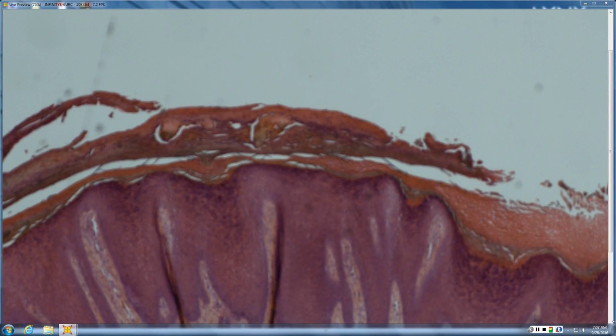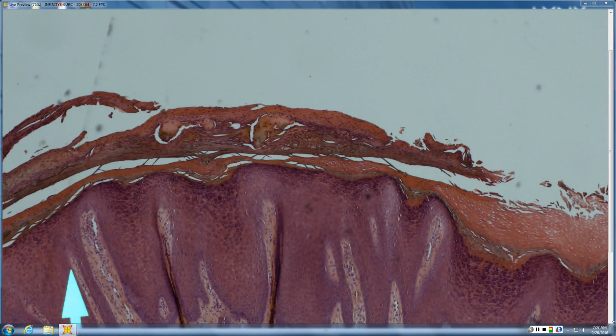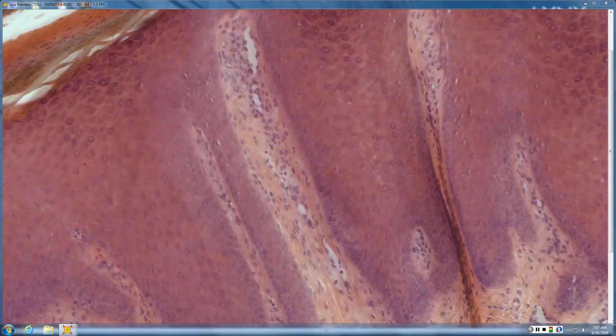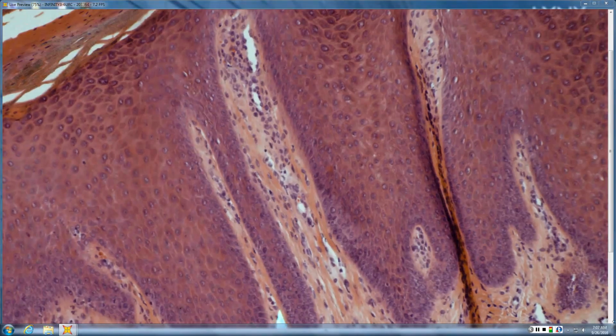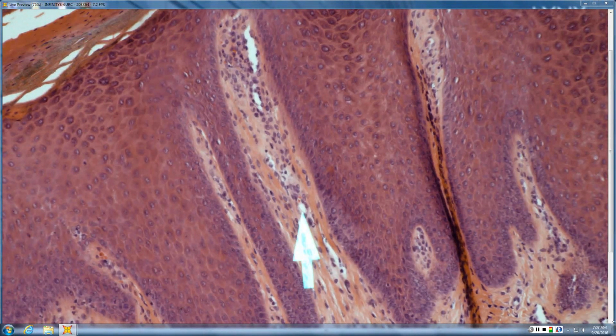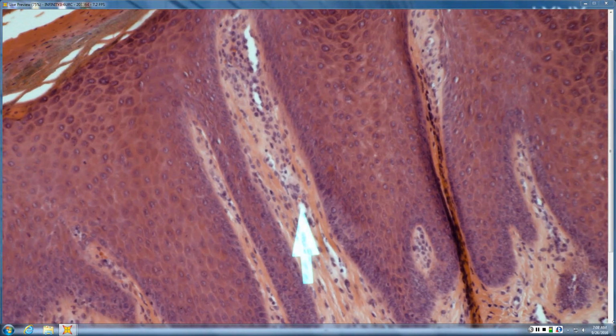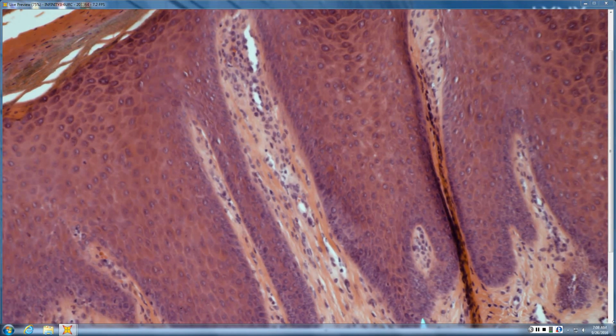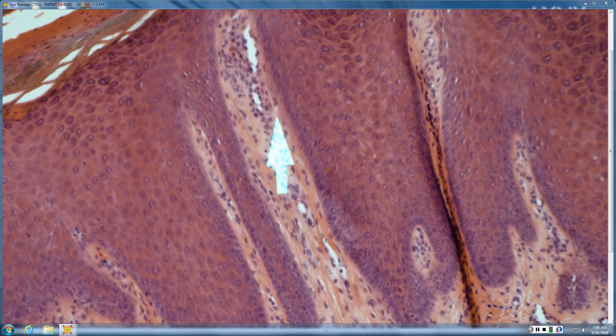But another thing to distinguish the two is this papillary dermal fibrosis that's particularly with vertical streaks of collagen. So that is different from psoriasis and something that is highly characteristic of that chronic fibrosis, that chronic LSC feature. And so you can see the kind of vertical streaking of collagen. And you do get some angiofibroplasia as well. That's sort of another term for what's going on here. Looking at blood vessels isn't going to necessarily help a whole lot because you can, of course, get increased blood vessels with psoriasis as well.